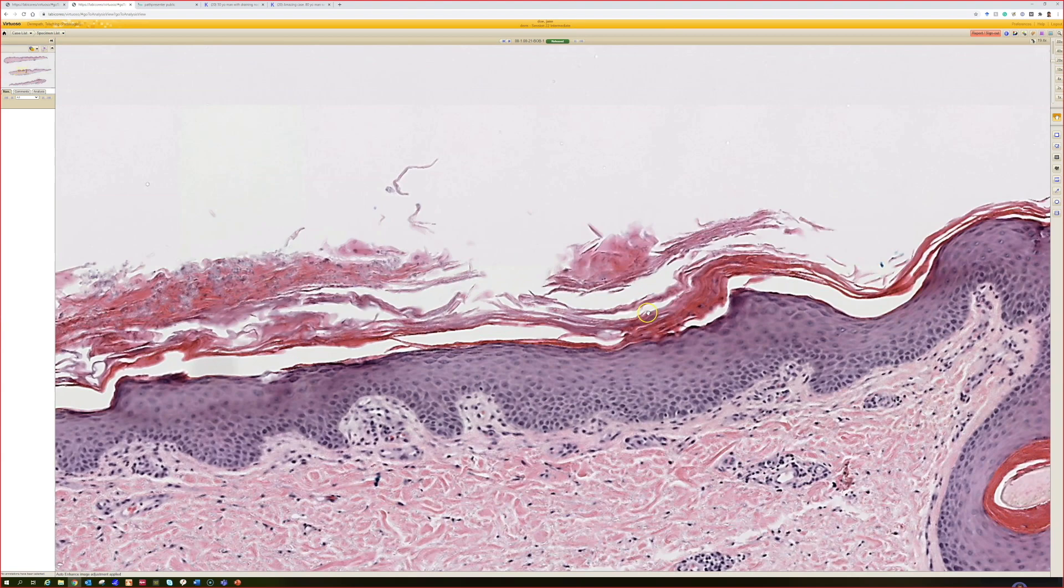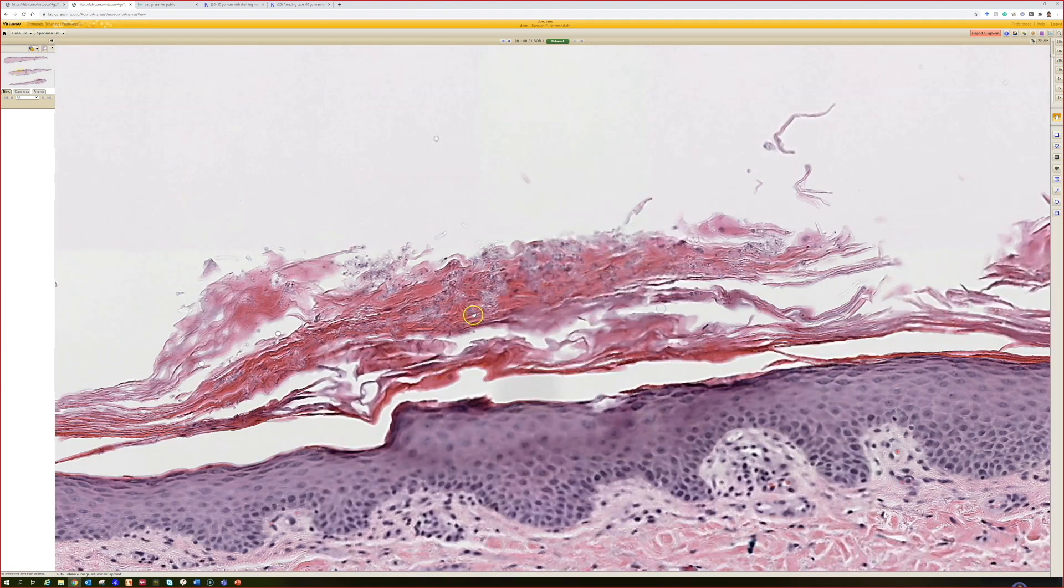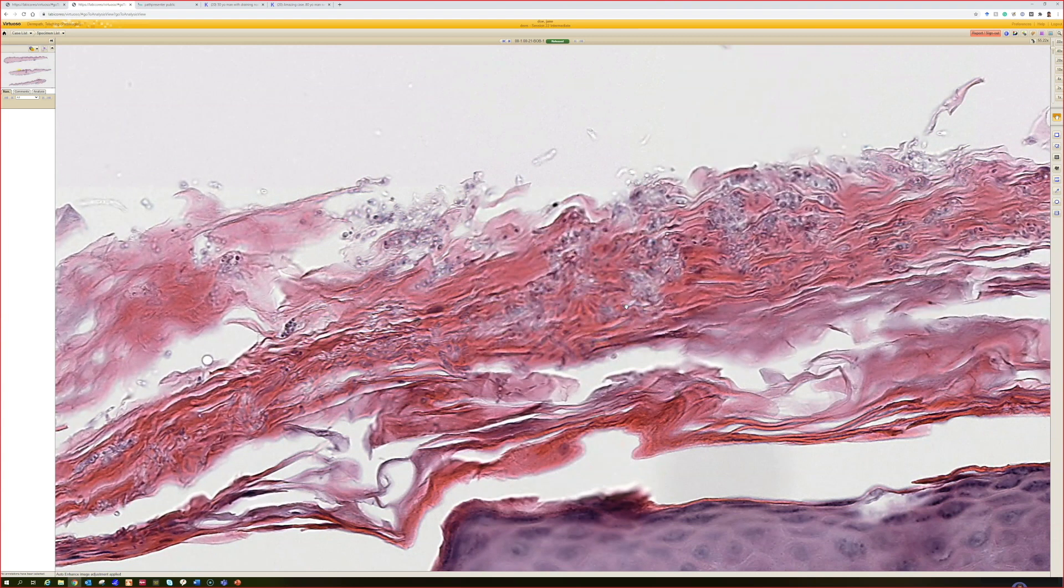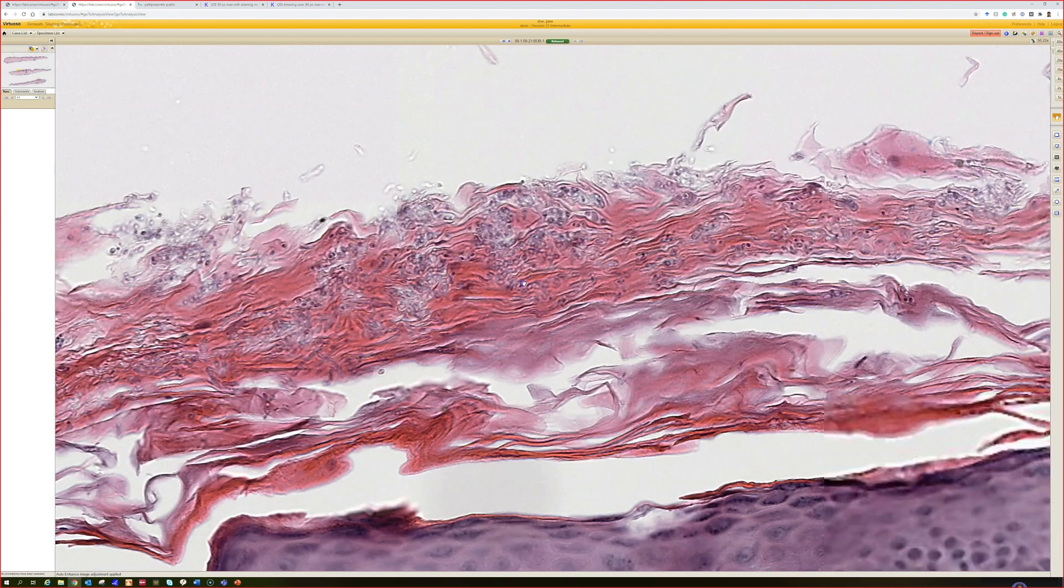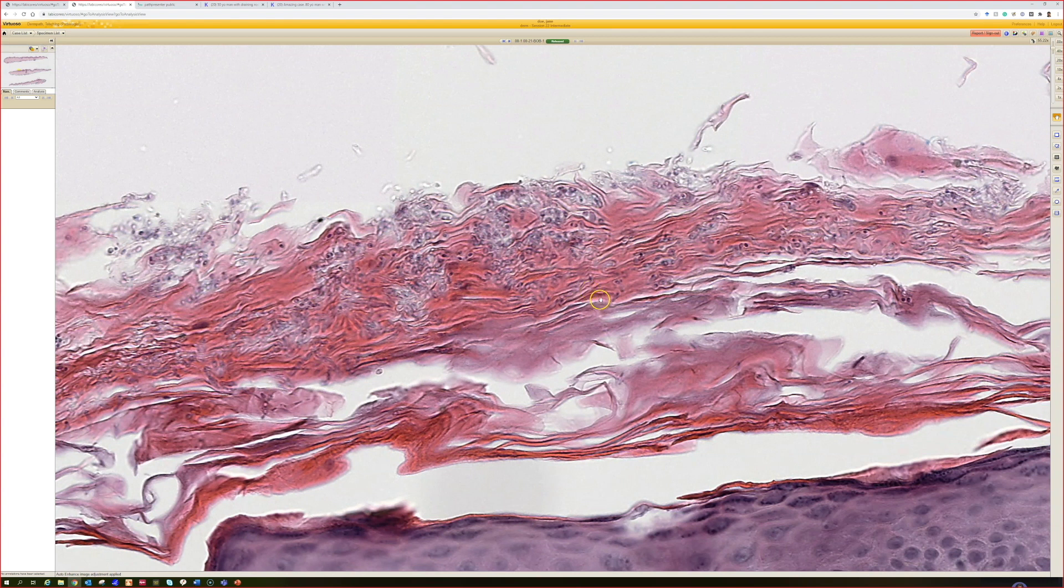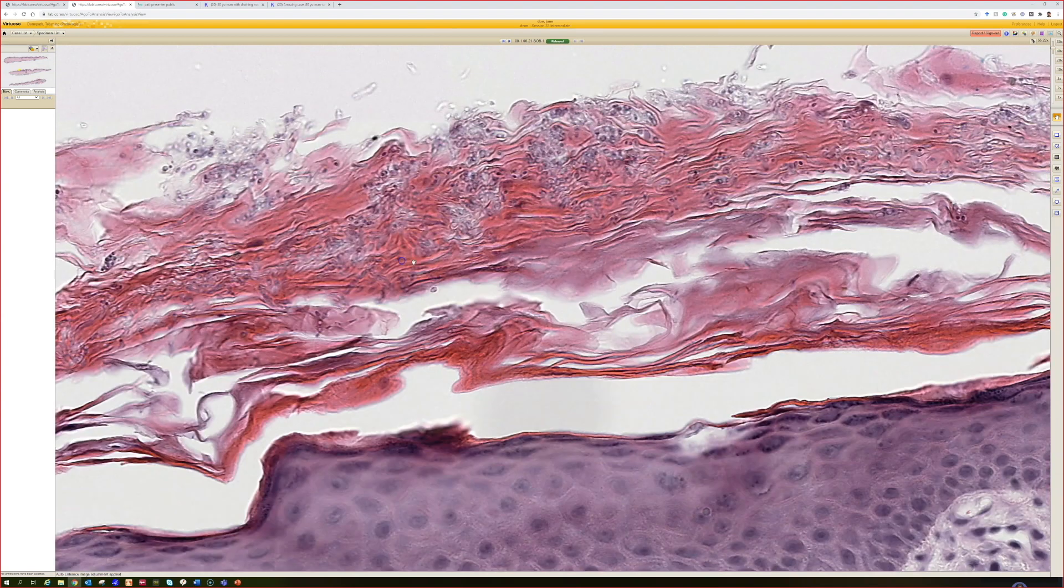When I went in really close on those mounds of ortho hyperkeratosis, I could see some little organisms like spaghetti and meatball. A little short hyphae, kind of that bluish color that you were talking about, so it's tinea versicolor. Yeah, exactly.